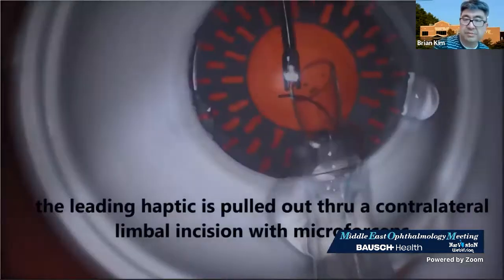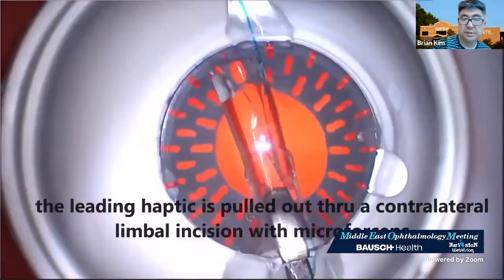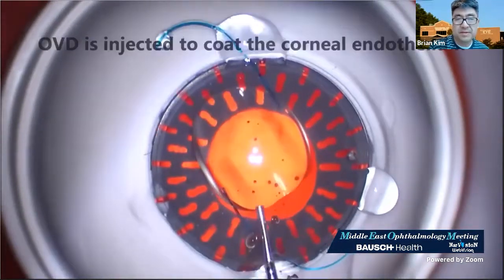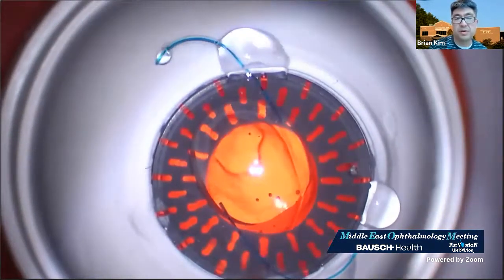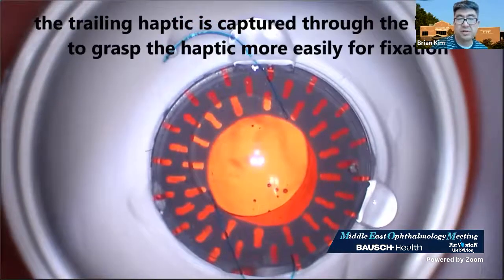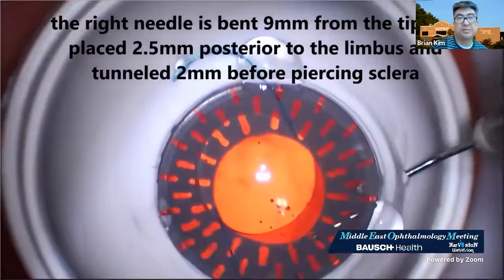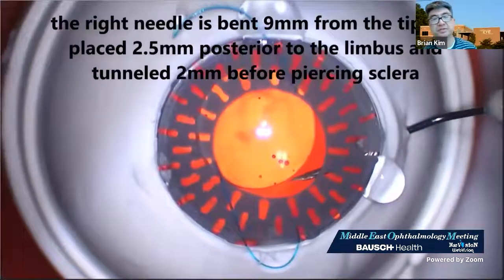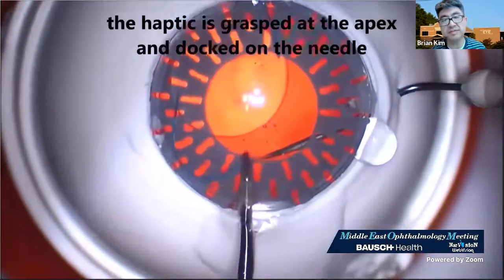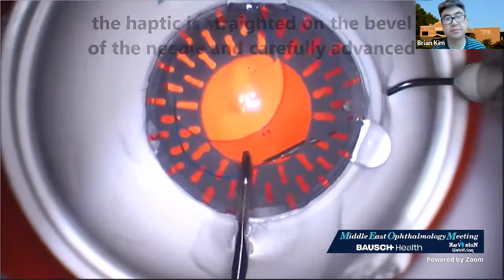So you see the leading haptic is pulled out through the contralateral limbal incision with microforceps. You always want to coat the corneal endothelium once the lens is delivered. The trailing haptic is captured within the incision. The right needle is bent 9 millimeters from tip, placed 2.5 millimeters posterior to the limbus, tunneled 2 millimeters. The haptic is grasped at the apex, flattened out, and then it's threaded into the needle.